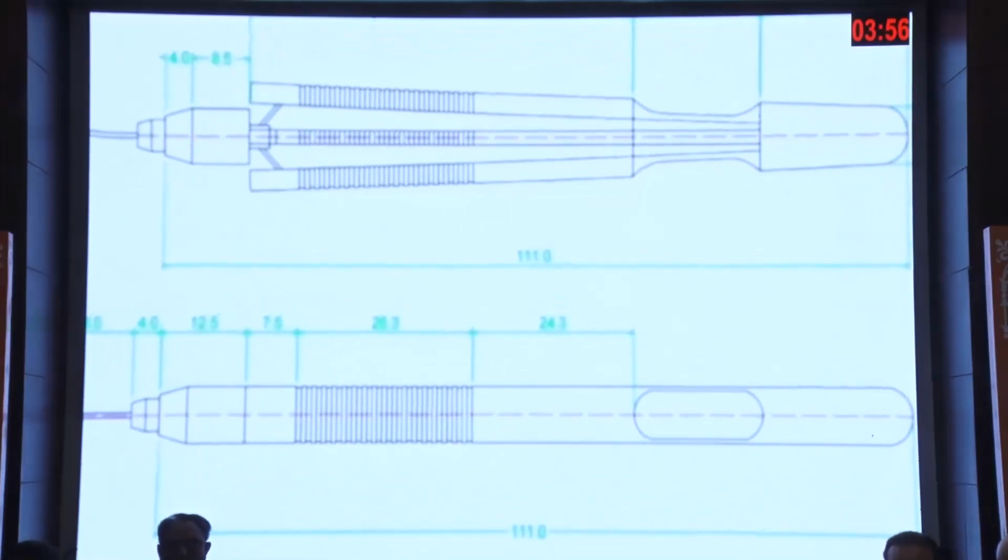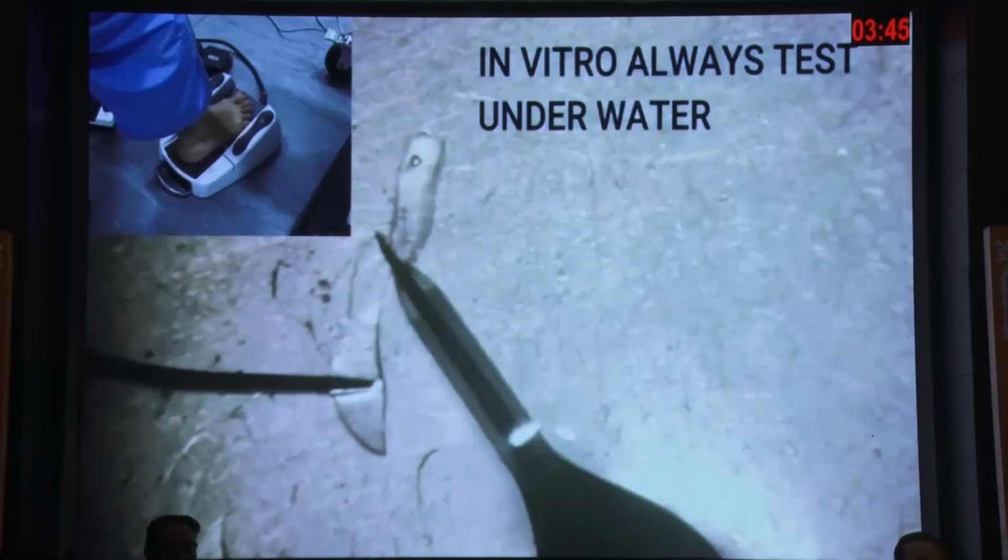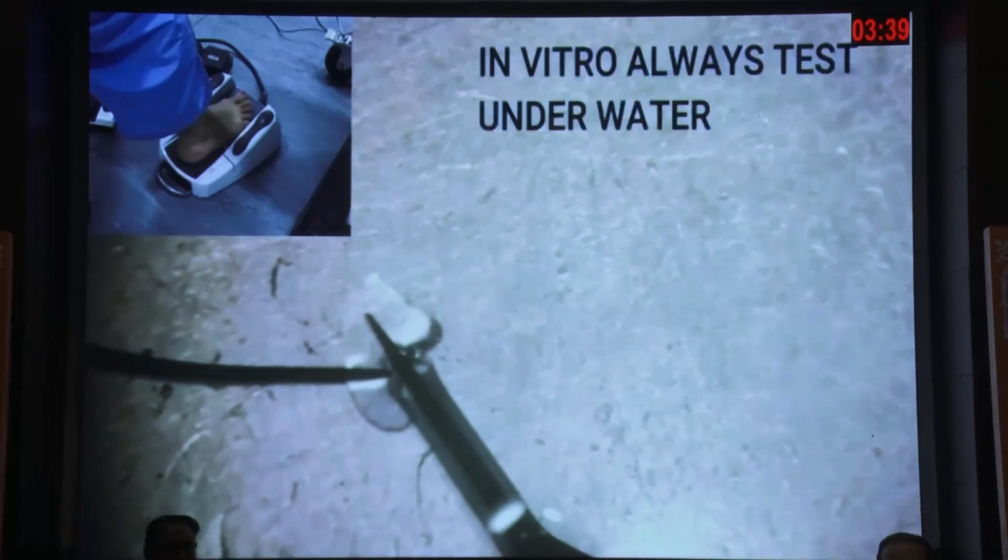These are the forceps which help in holding the IOL through the side port. They are ergonomically designed. So once we've held the IOL, all one has to do is just press on the foot pedal, and it smartly uses the ultrasonic power of the phaco machine and the phaco probe to slice the IOL.